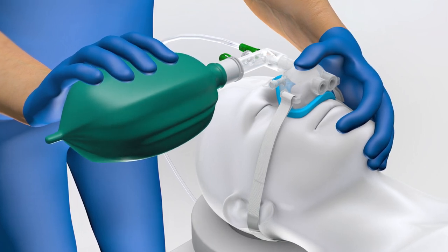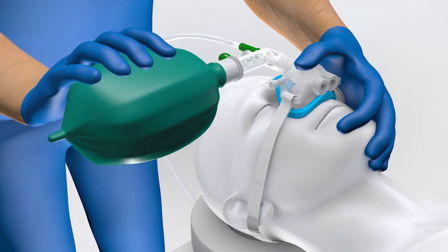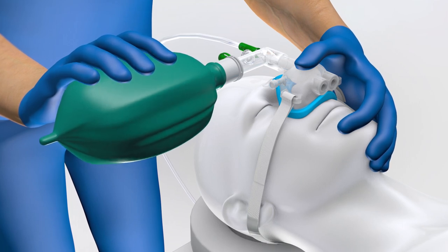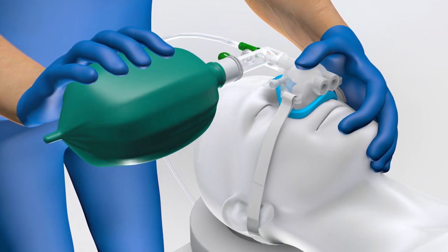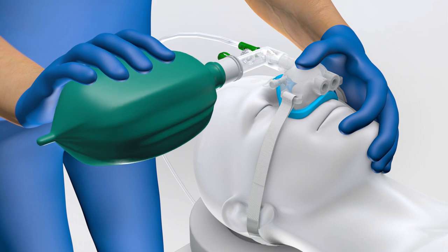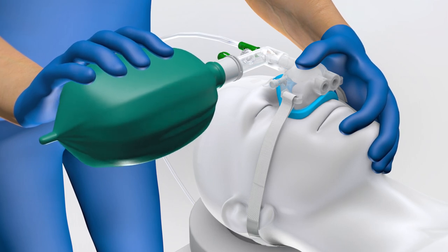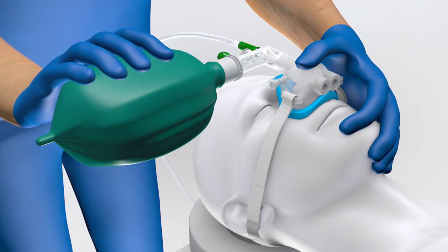The SuperNova device used in this manner can also be used during patient transport and recovery for patients at risk for respiratory compromise post-operatively due to surgical conditions, patient characteristics, or residual anesthetic medications.